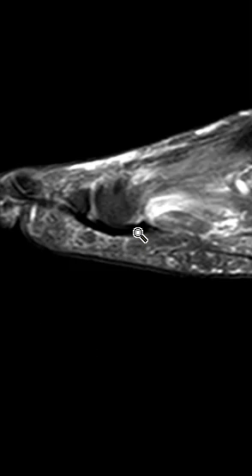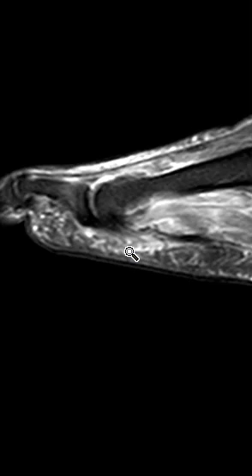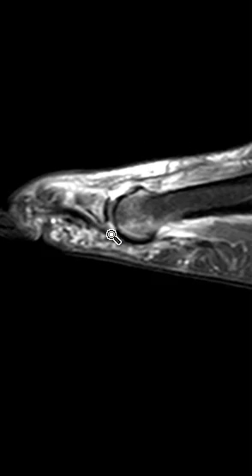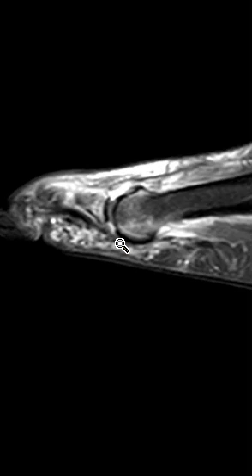I'll always go to another one to compare — this is the third metatarsal head, and the plantar plate looks nice and thick. Here the middle part looks pretty good as well. So the normal plantar plate looks a little bit more thick. Now going back to the fourth, this looks a little attenuated — here it looks probably absent — and here you can see just a little piece of it.